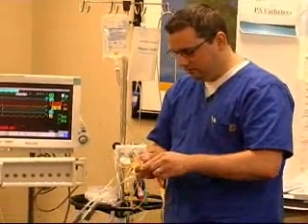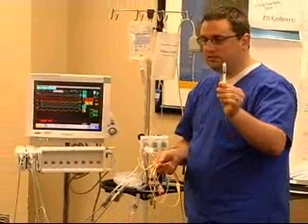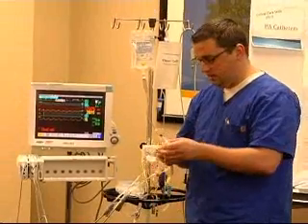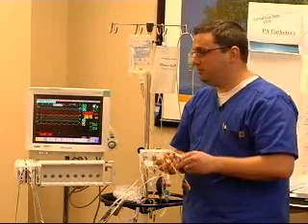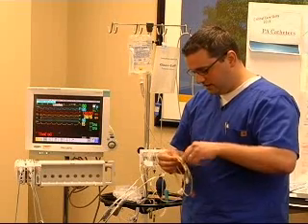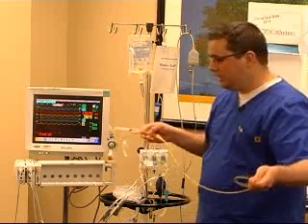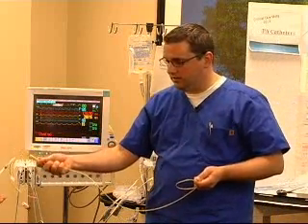All right, so they're going to hand you the syringe, which is a 3 cc syringe set with a barb on it for 1.5 mLs. You can't use any other type of syringe on there because you could overfill the balloon and rupture it. So they're either going to put the syringe on or hand the syringe to you, and then they're going to sterilely hold on to this and hand this off to you.